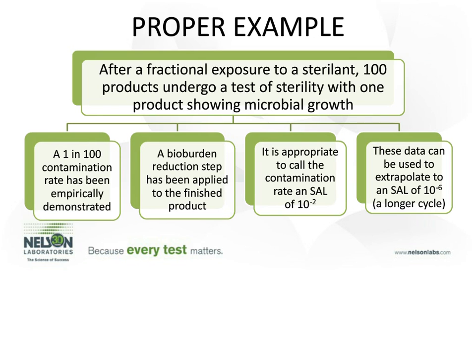Thank you, Wendy. So to start off with an example regarding sterility assurance levels and when it is appropriate versus not appropriate to apply that term.